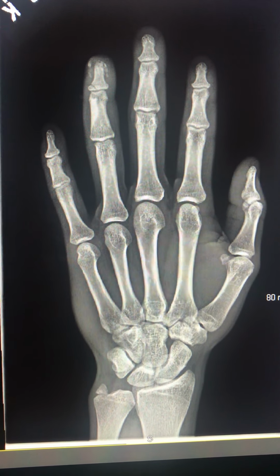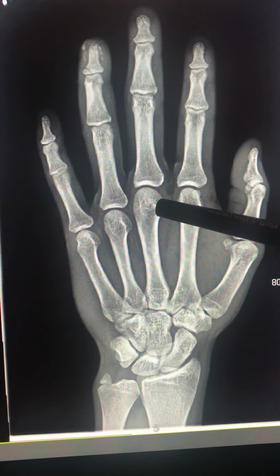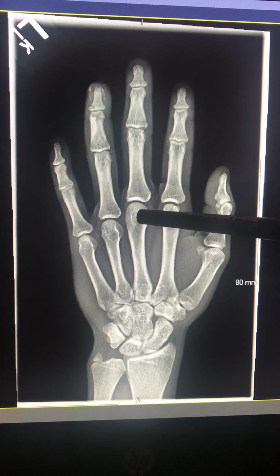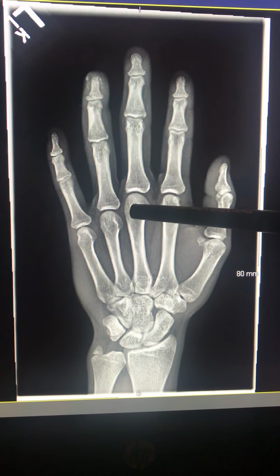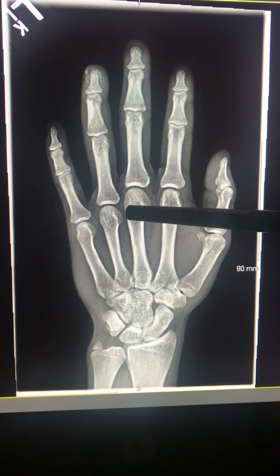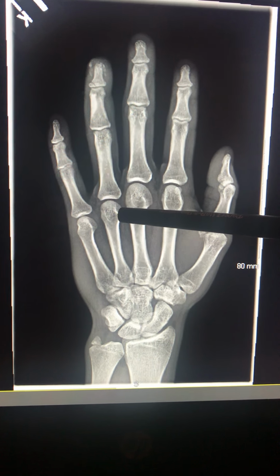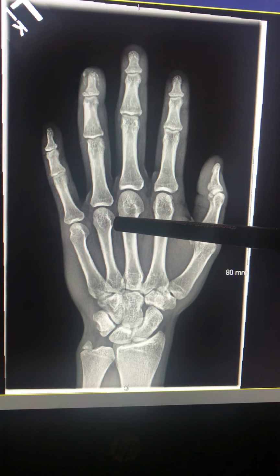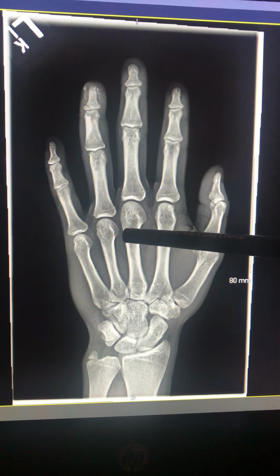The CR was centered to the MCP and collimated on all 4 sides. The patient extended the fingers and slightly separated them, palm down. Patient was in pain but was able to maneuver the position. The position of the hand is accurate in its orientation.